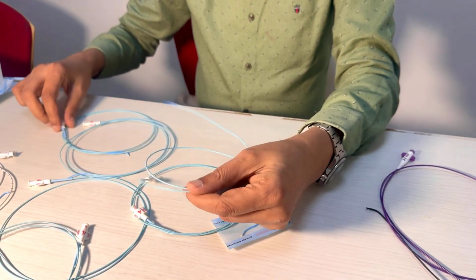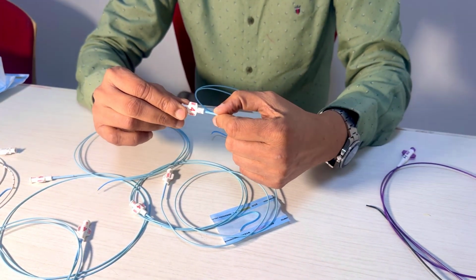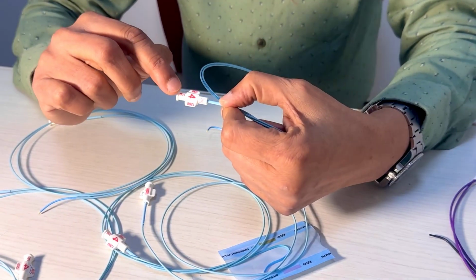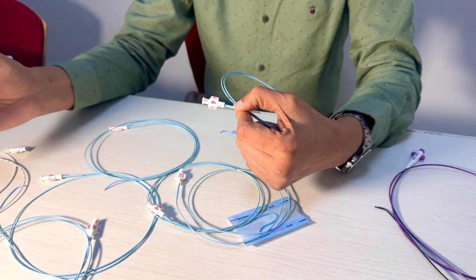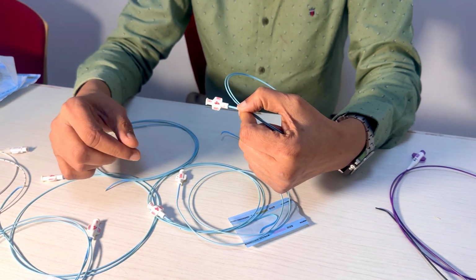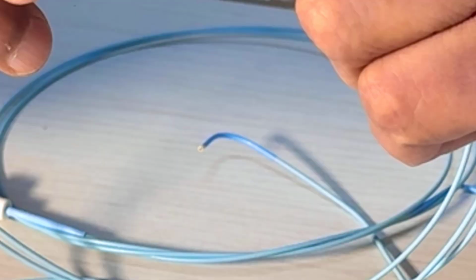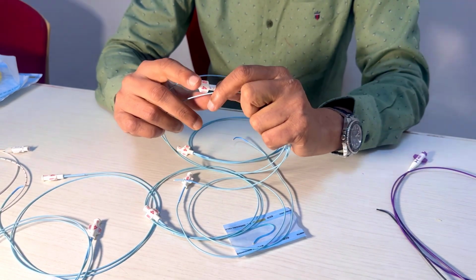Now, first of all, when you take a catheter in your hand, take a look at the hub. There are many things upon this hub. For example, when you look at the hub, you get 100 written over here. So what does 100 mean? It means that the length of the catheter is 100 centimeters. Get it? For example, if I take another catheter, the hub says 125. So what does it mean? The length of this catheter is 125 centimeters.